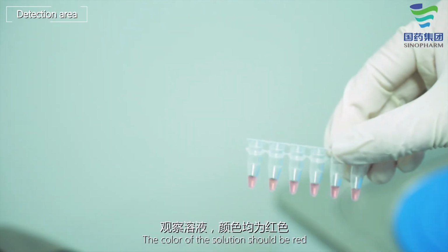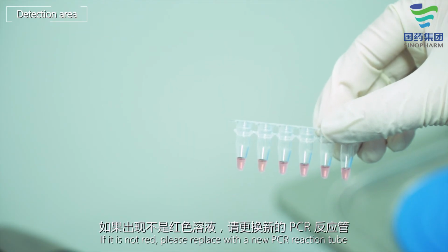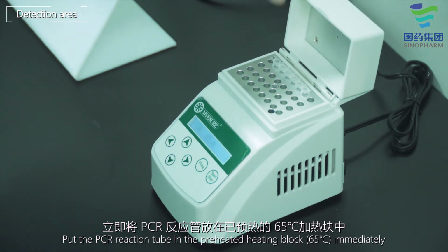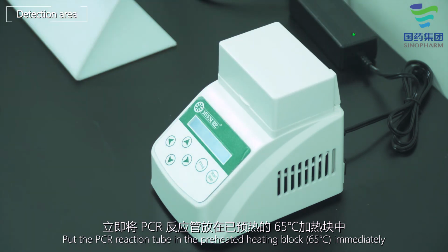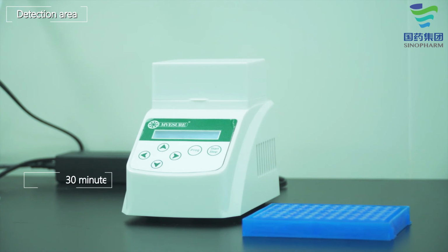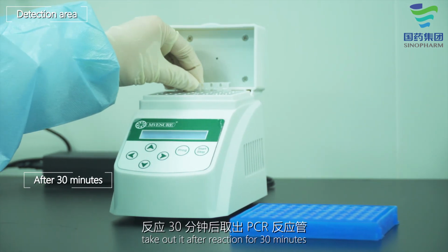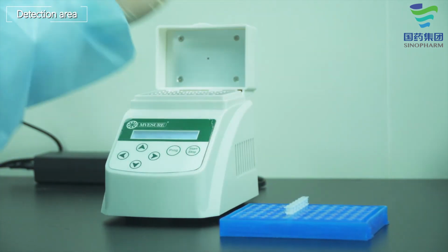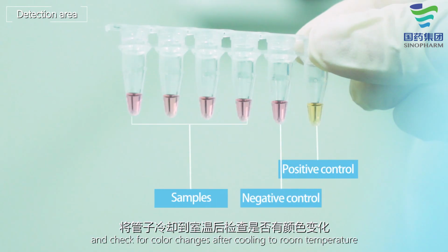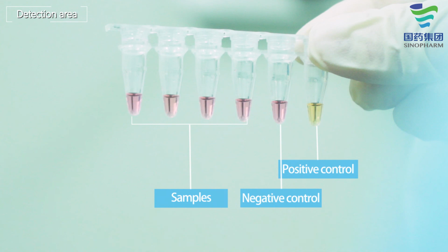The color of the solution should be red. If it is not red, please replace it with a new PCR reaction tube. Put the PCR reaction tube in the preheated heating block at 65 degrees centigrade immediately. Take it out after reaction for 30 minutes, and check for color changes after cooling to room temperature.